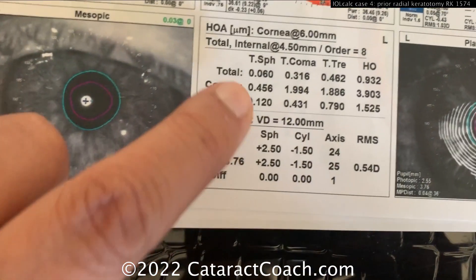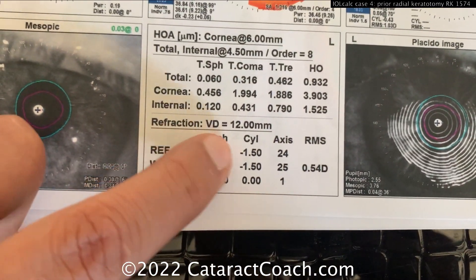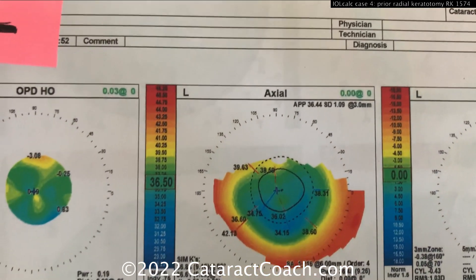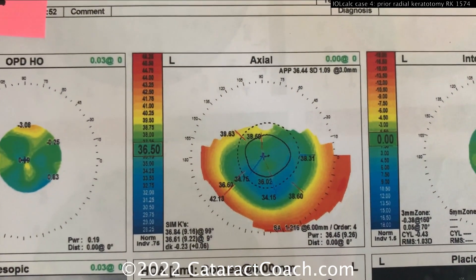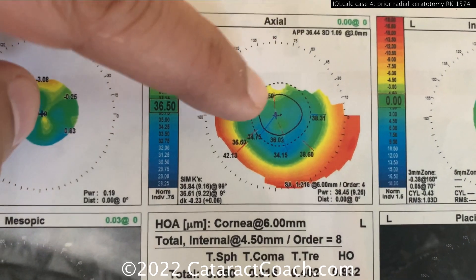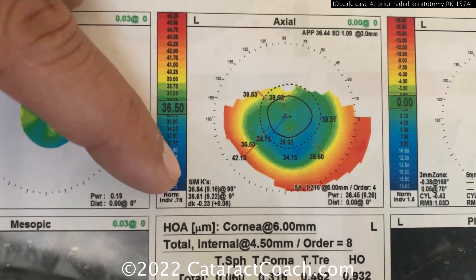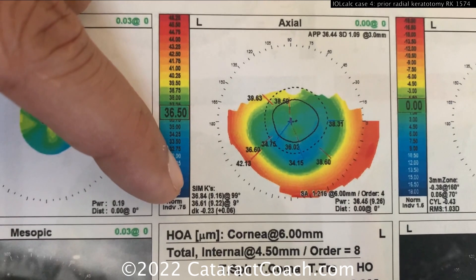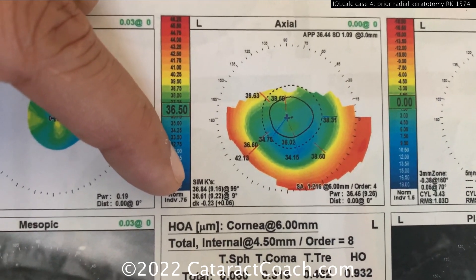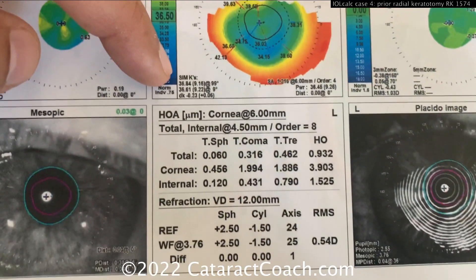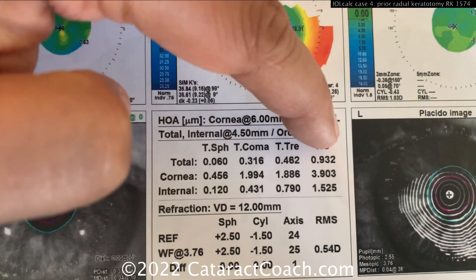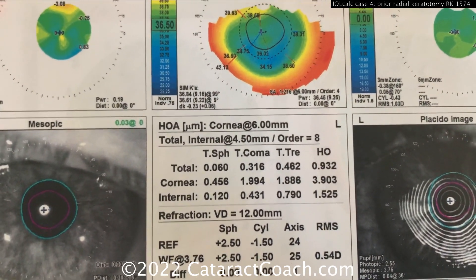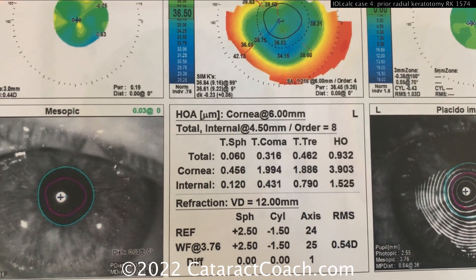The current refraction shows a little bit of hyperopia and some astigmatism. Looking at the K values on the axial mapping, that central cornea is really flat — K value is somewhere in the 36 diopter range, so really quite low. There are also some additional higher order aberrations in these eyes because of the changes from the radial keratotomy.